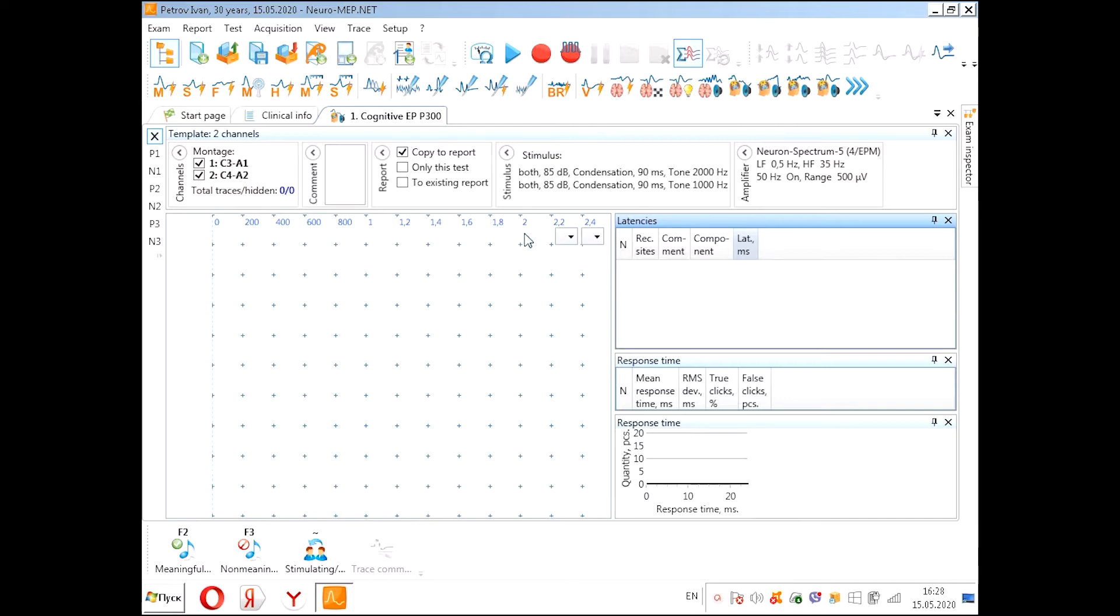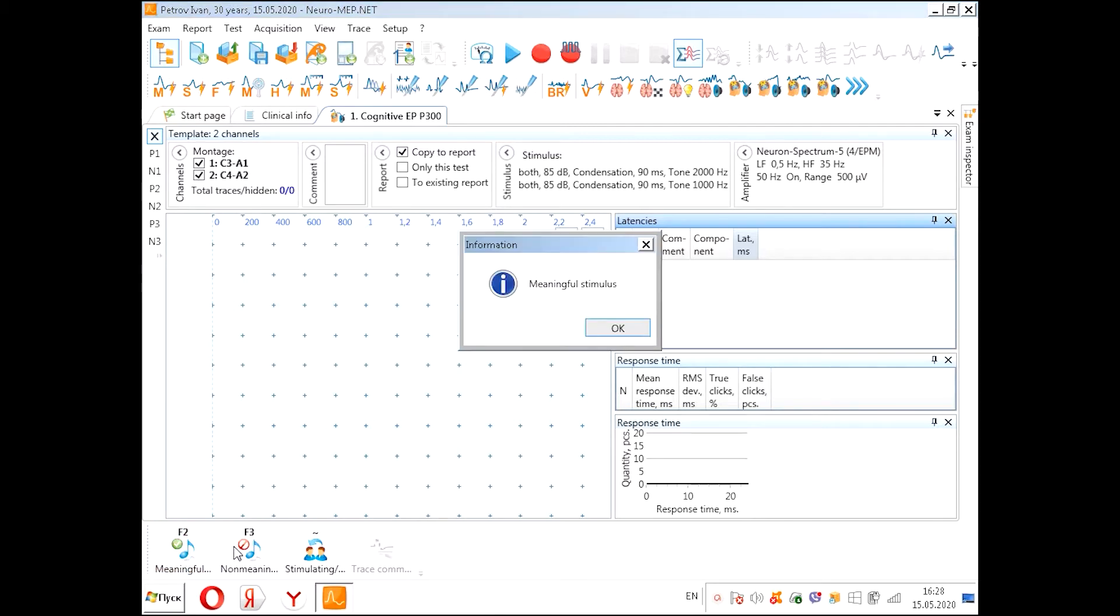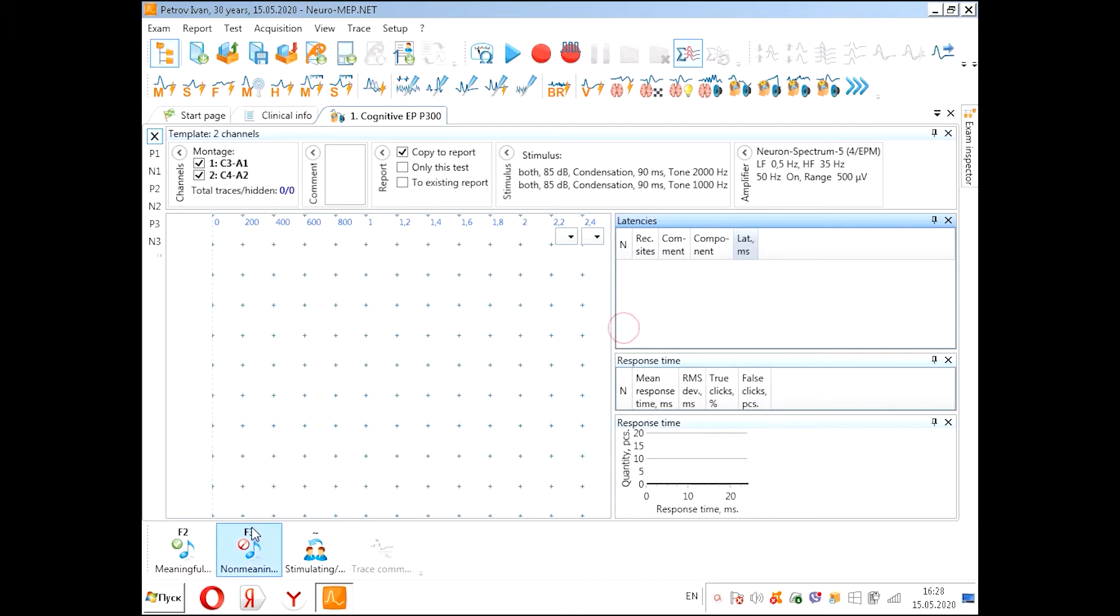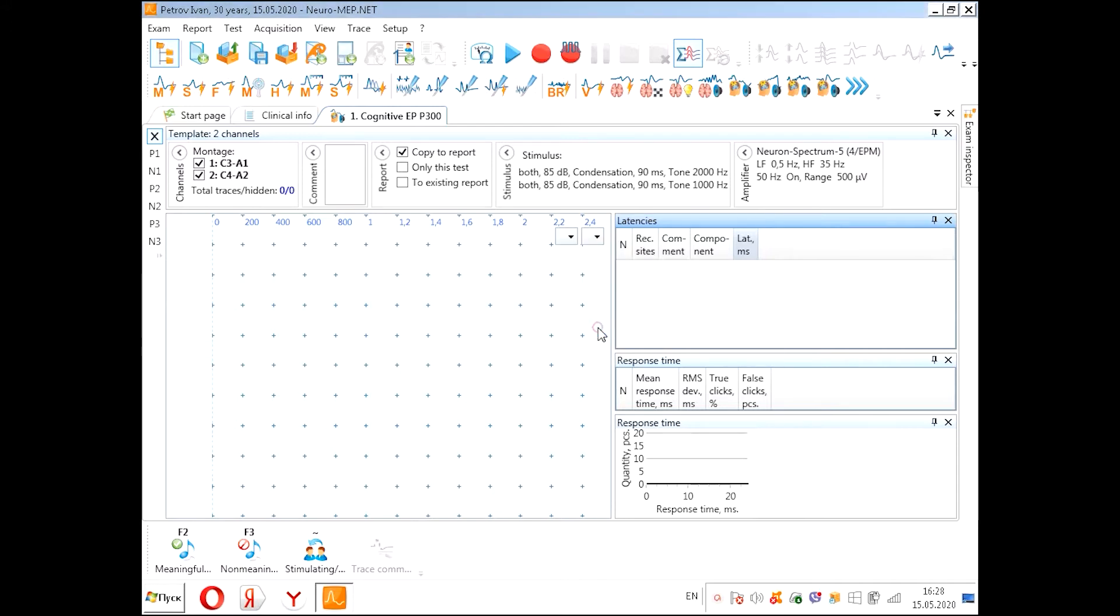We must instruct the patient to push the button on the meaningful stimuli. Press this button and our patient will hear the sound and push the button. When the patient will hear non-meaningful stimuli, don't push the button. So we instruct the patient.